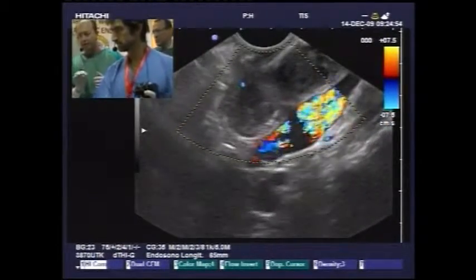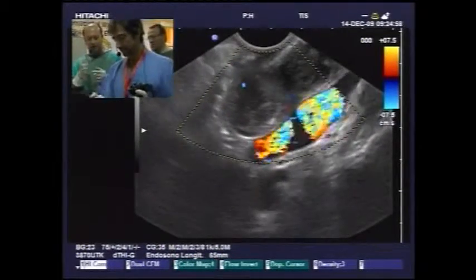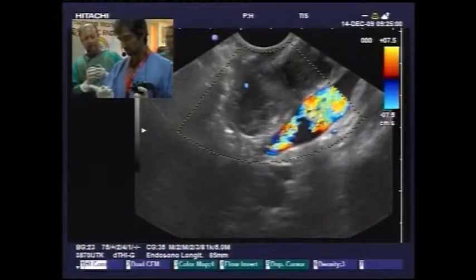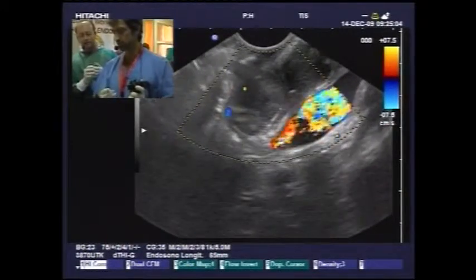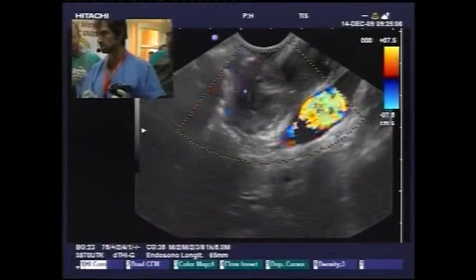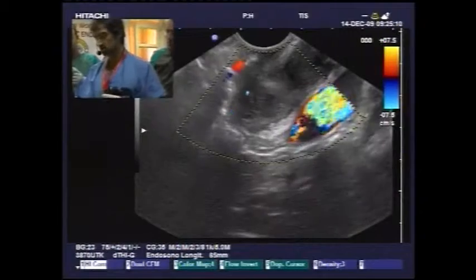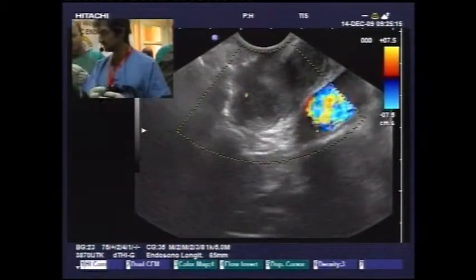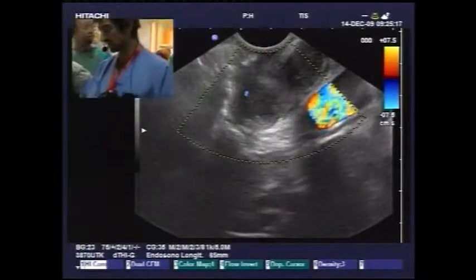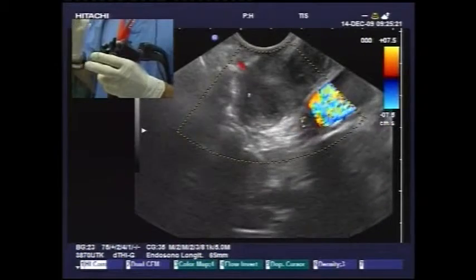I think it's worth it this time to allow Paolo to discuss some of the very nuanced details of how he's going to perform this FNA, because he's taught me some new things out in the hallway. So first of all, in this case, for the lymph nodes, I prefer to use a 19-gauge needle because of the possibility to obtain a core for the diagnosis. Everybody that is using fine needle aspiration knows that the 19-gauge needle is very hard to use because of its stiffness.